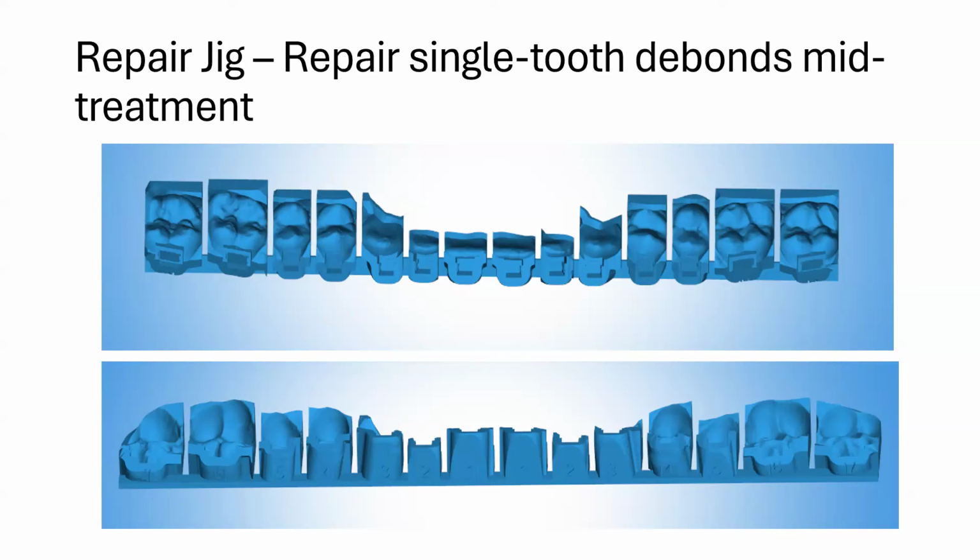New hires that we onboard pick it up surprisingly well, and it may just be that we have some veterans who can train at a high level. I don't know. We have two new RDAs in our office, and they both just started doing transfers probably a month ago, and they've just got it down. So it's been a smooth process for us.